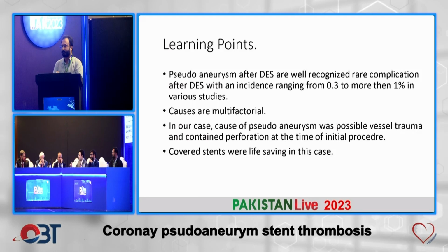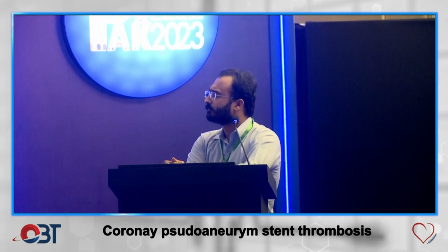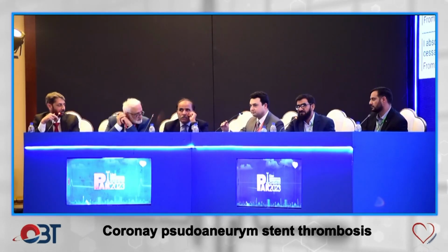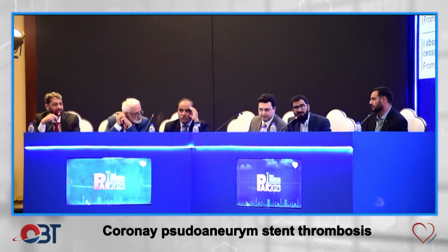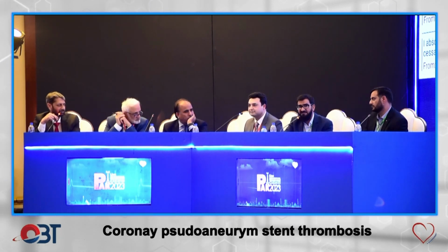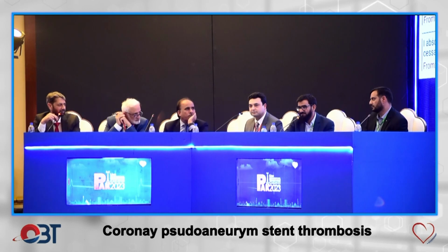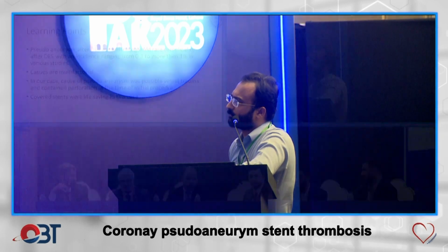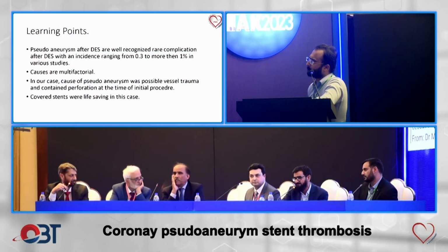Any comments? I think as far as the first stent was concerned, there was some haziness in the middle of the stent, and maybe you can show the first views. Fracture of the stent starts in the beginning. That has caused all these things. Second, I don't think that there is formation of pseudoaneurysms in the so early phase. As far as the hemodynamics is concerned, there might be a fistulous formation, or there is a frank perforation which is opening into the cavity, and because of this there is no hemodynamic compromise.